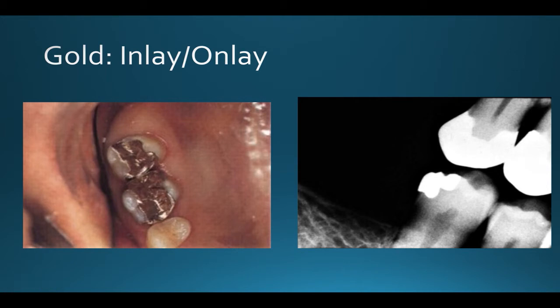If I have a one surface gold foil restoration, however, so if this was just a one surface gold, there would be no way radiographically for you to know whether or not it was amalgam or gold, so that's something you would have to look in the patient's mouth clinically to see.